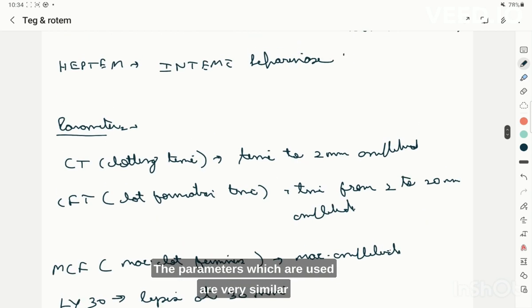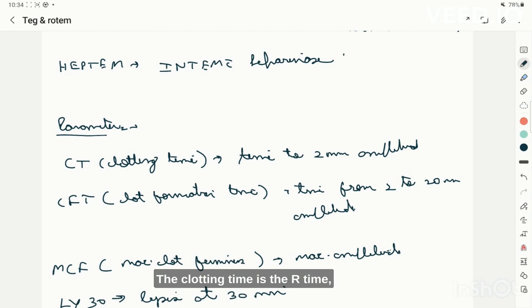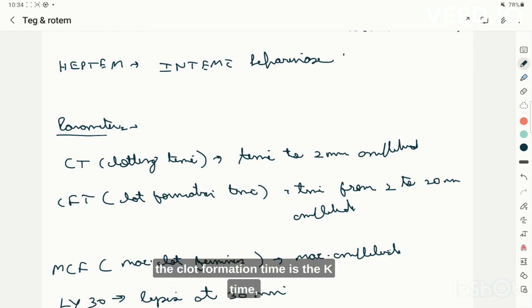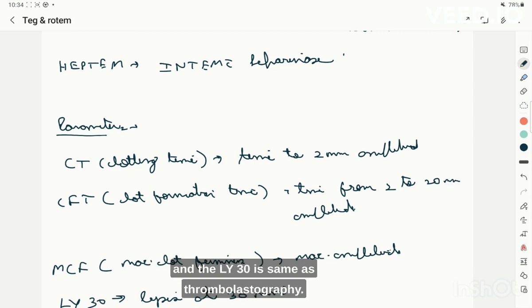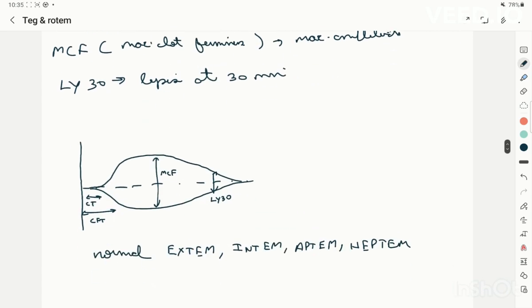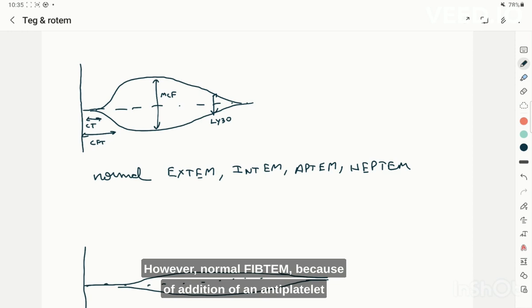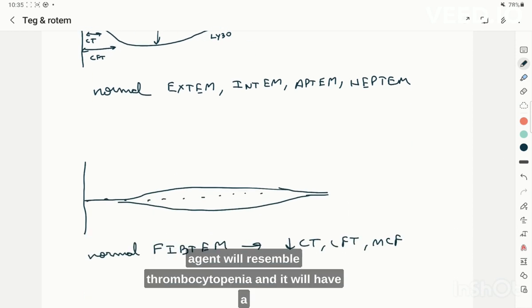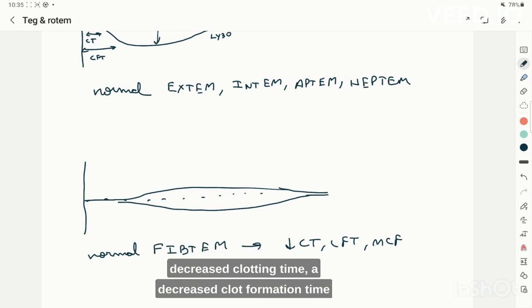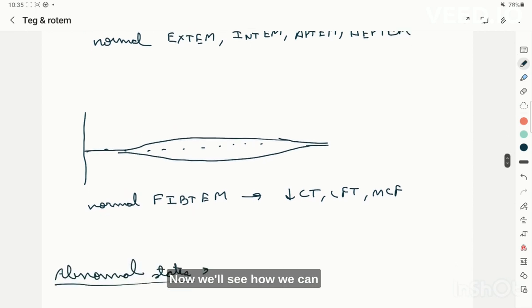The ROTEM parameters are similar to TEG but with different nomenclature: clotting time (CT) corresponds to R time, clot formation time to K time, maximum clot firmness to maximum amplitude, and Ly30 is the same. EXTEM, INTEM, APTEM, and HEPTEM appear as normal graphs in a normal patient. However, FIBTEM, due to the anti-platelet agent, resembles thrombocytopenia with decreased CT, decreased clot formation time, and decreased maximum clot firmness.